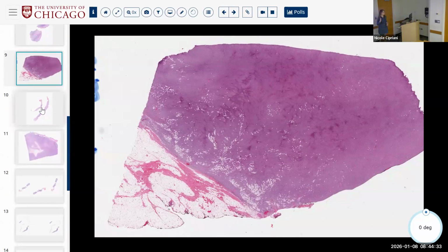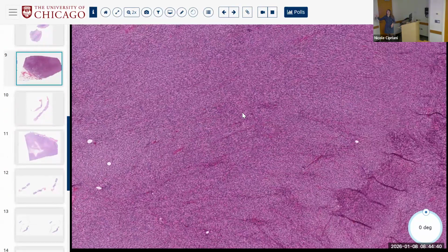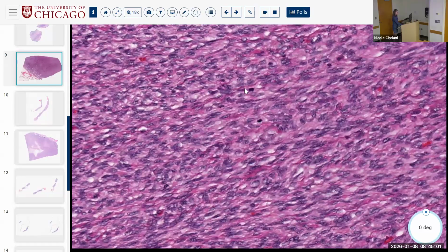What does fibrosarcomatous transformation look like? You start to get much more cellular, much longer sweeping fascicles. What's the buzzword name for this type of pattern? It's not storiform, but herringbone. Exactly. So these very long, very dark fascicles. This is beginning to be a longer fasciculated herringbone. And then you start getting mitoses, right? One, two. So this is fibrosarcomatous transformation of DFSP.